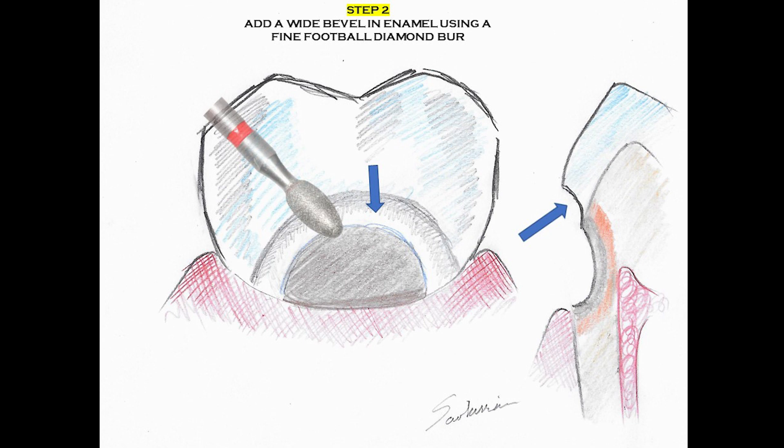I proceed with placing the wide bevel with a red striped football diamond. As we know, the extent of the true cavity in the tooth is a lot wider and deeper than what it initially presents.